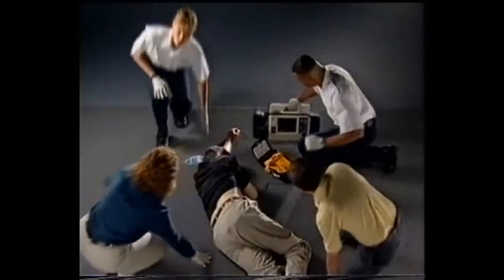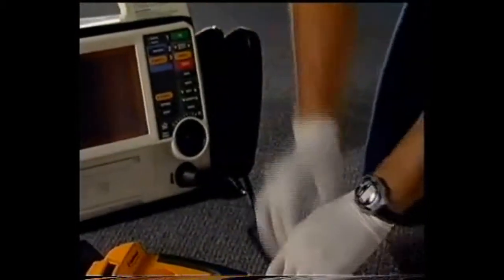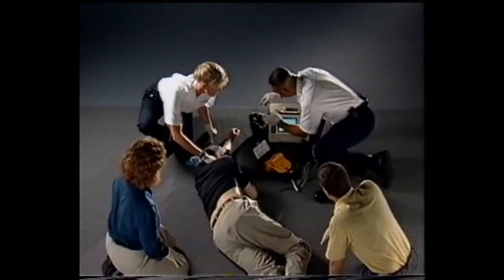When emergency medical personnel arrive, they can simply disconnect the electrode pads from the first defibrillator and connect to their Medtronic LIFEPACK defibrillator monitor. And that's it. Those are the steps for using an automated external defibrillator to help someone who's collapsed from sudden cardiac arrest. Here's a quick summary.